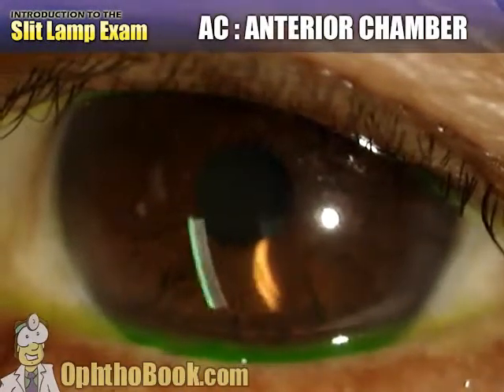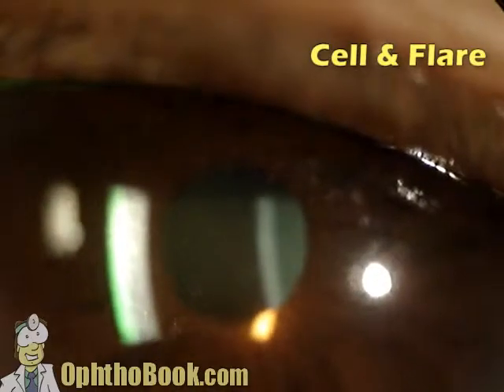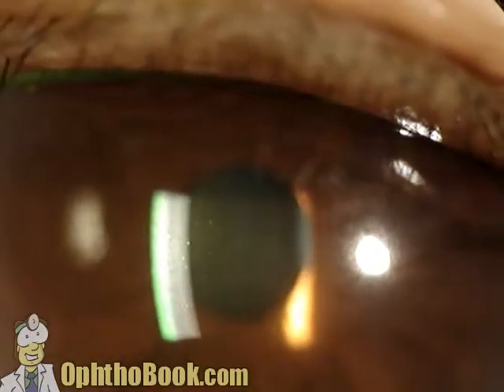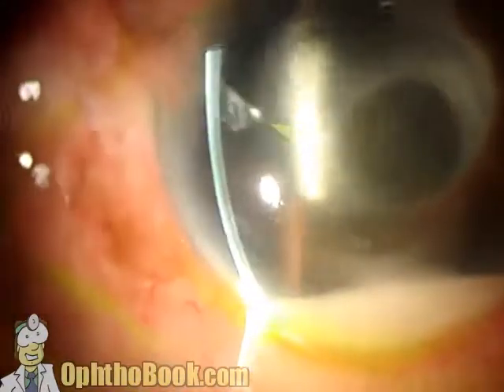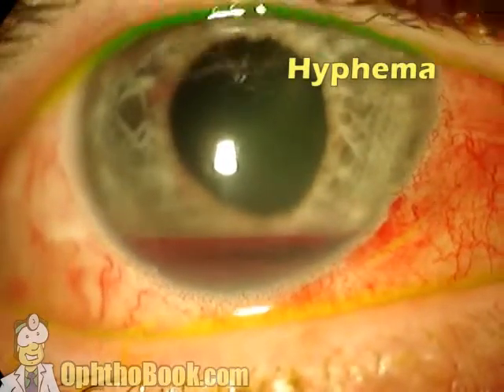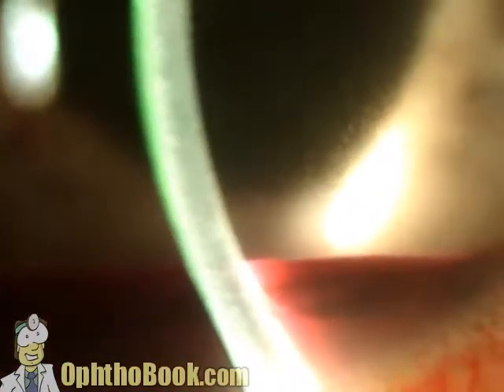For the anterior chamber: make your light beam shorter, a little thicker, and turn the intensity as bright as you can to see cell and flare. Cells are individual cells floating in the space; flare is that foggy appearance from protein released by inflamed blood vessels. The brighter the light and the darker the pupil background, the easier it is to see. With enough inflammatory cells settling to the bottom, you get a hypopyon — which can be sterile or infectious, as seen here from an infected tube shunt. This is emulsified silicone oil from retinal detachment surgery that floated to the top — silicone is lighter than water — creating almost an inverse hypopyon. Blood is heavier than water, so this hyphema has sunk to the bottom, and you can actually see two layers of blood — a fresh one on top.